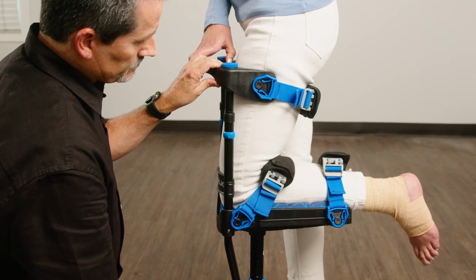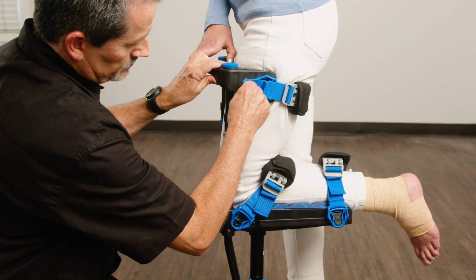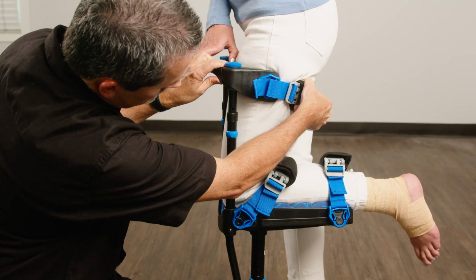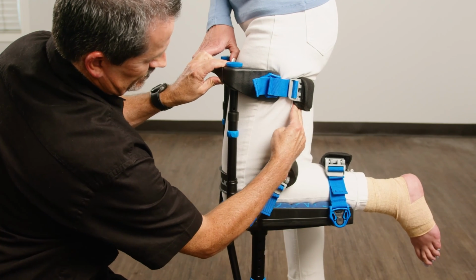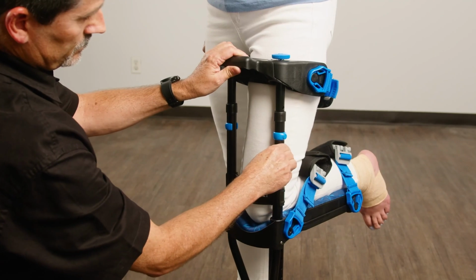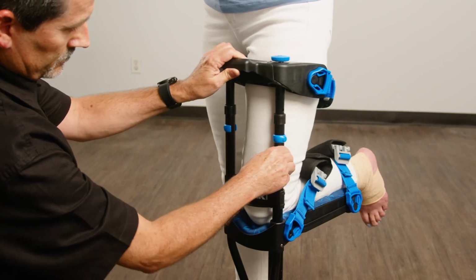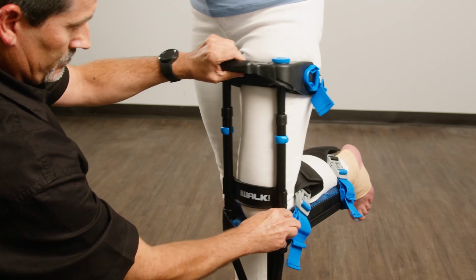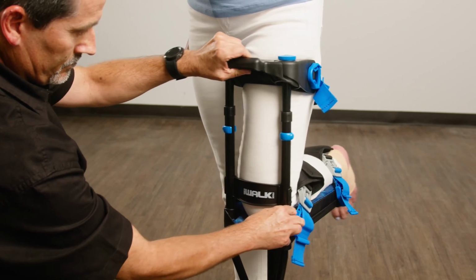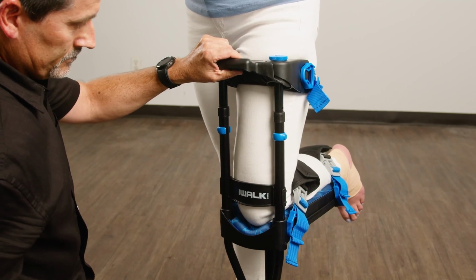In order for the iWALK to function properly and to provide the easiest patient adaptation, the straps need to be very tight. Properly tensioned straps prevent unintentional movement of the crutch. If the straps are too loose, the patient's control of the crutch is reduced, which can make the crutch feel unstable. Properly tensioned, the crutch becomes an integral part of the patient's leg, is easily controlled, and feels very stable.